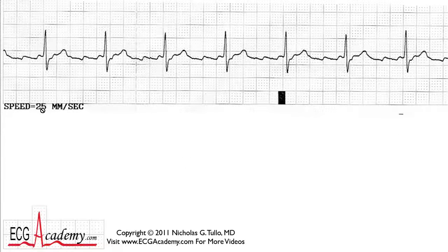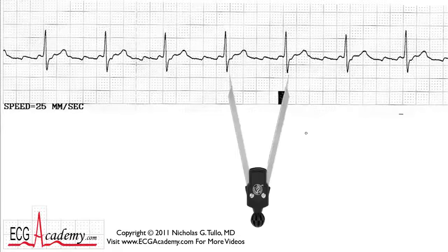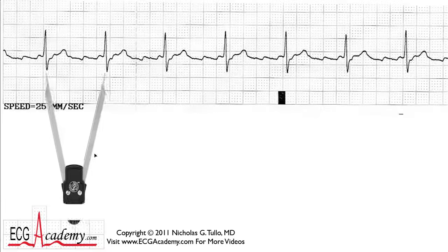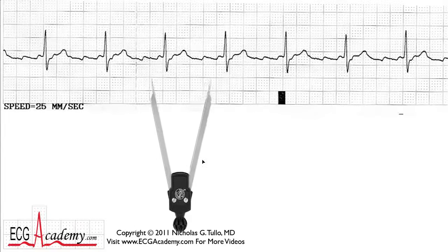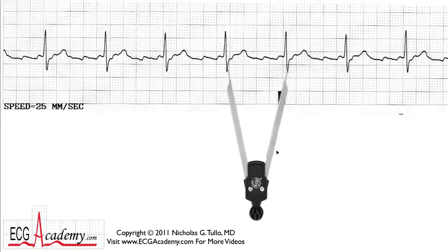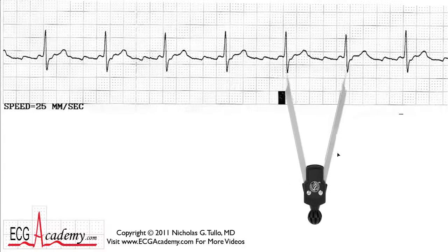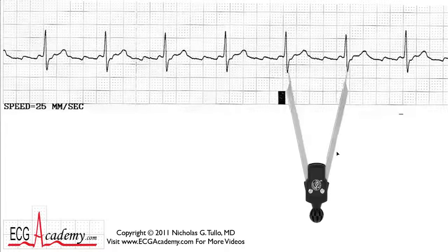Let's look at the forest first. You see the QRSs kind of marching through and they look pretty regular. Let's grab our calipers and take a look and see whether they are indeed regular. I happen to have them at the right rate, and the QRSs certainly do appear to be very regular.